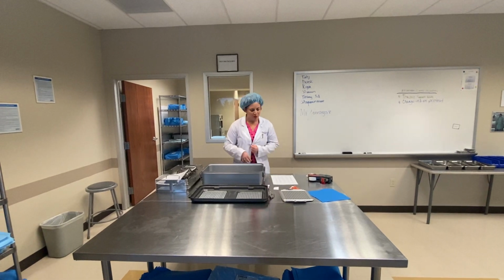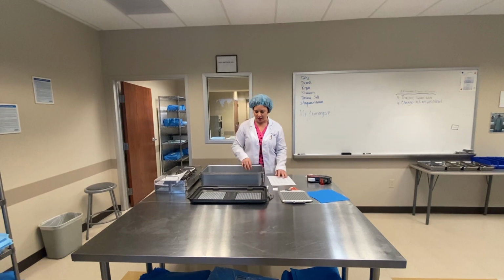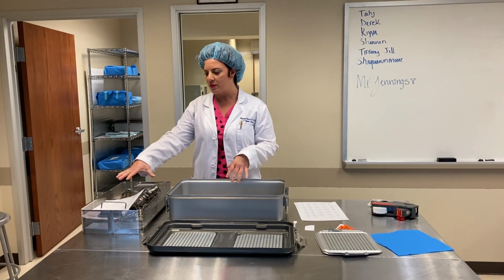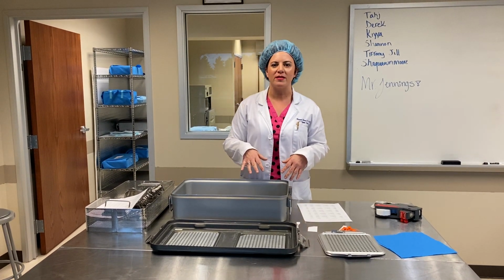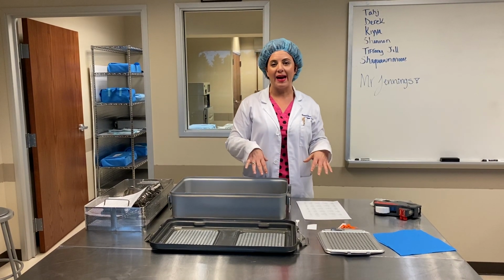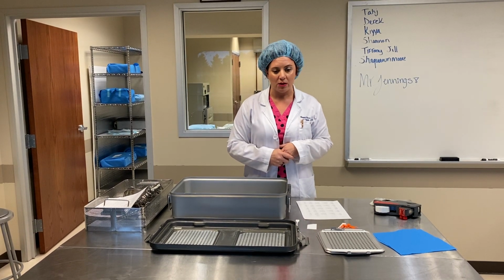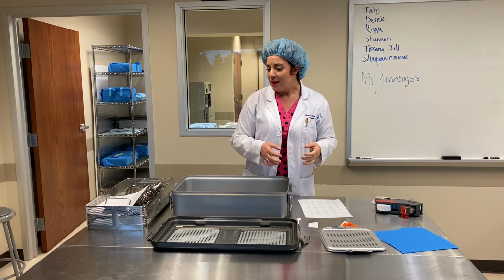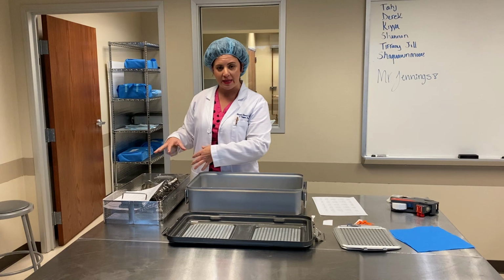Hi everyone, we're going to be talking about rigid sterilization containers. If you remember before when we were in the lab, we talked about how to assemble an instrument tray. So I came over here to our sterile processing lab. This is the prep and pack area. This is where they would be doing this in the hospital, in the prep and pack department of the sterile processing department. So the instrument tray is already assembled and prepped.